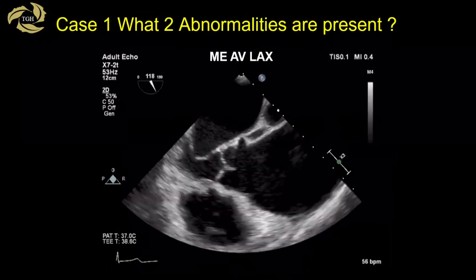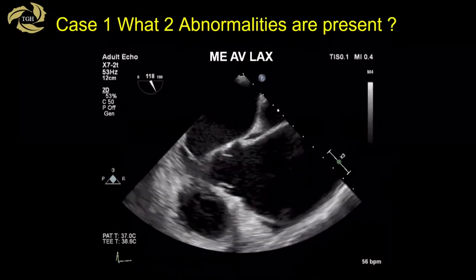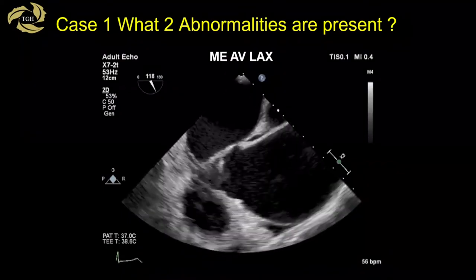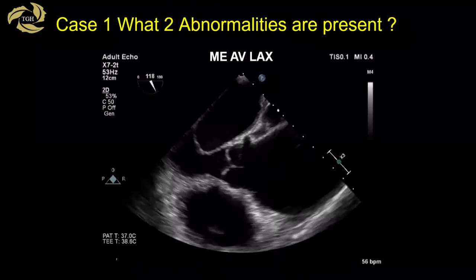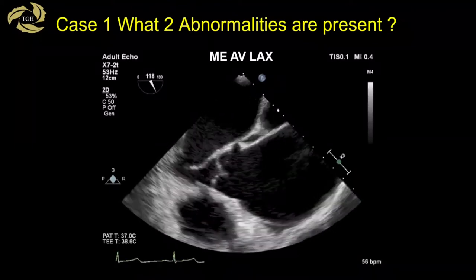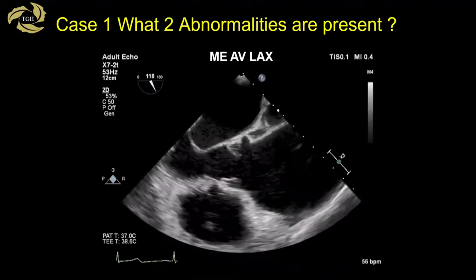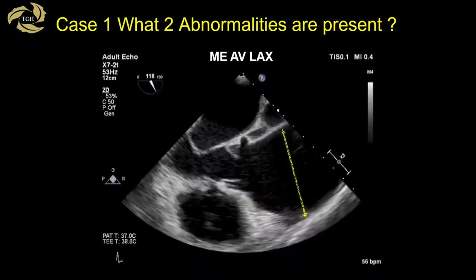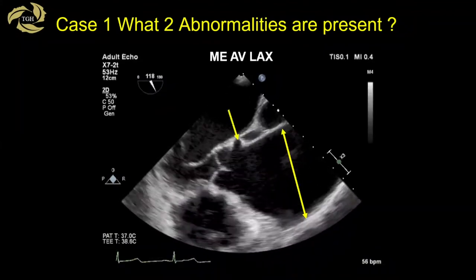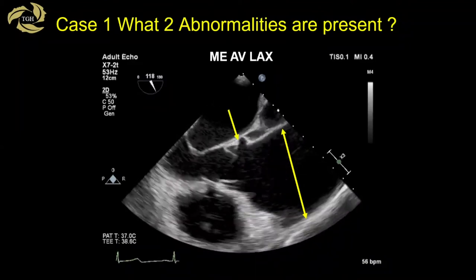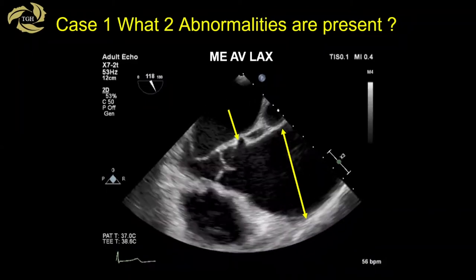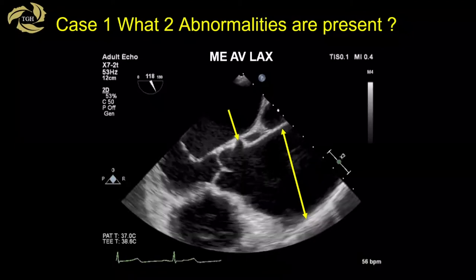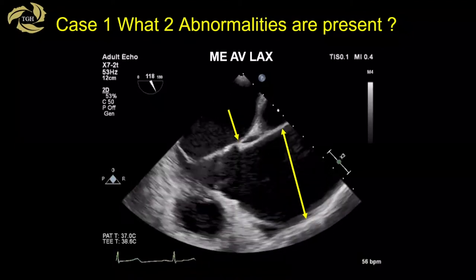Here's the money image — there are at least two abnormalities present. It's a mid-esophageal aortic valve long axis view at 118 degrees with most of the left ventricle eliminated. The first abnormality: the ascending aorta appears dilated. The second abnormality, marked with a single arrow, is a displaced left coronary artery — normally not seen in this view, but visible in this patient. Identifying coronary anatomy can be important when assessing aortic insufficiency.